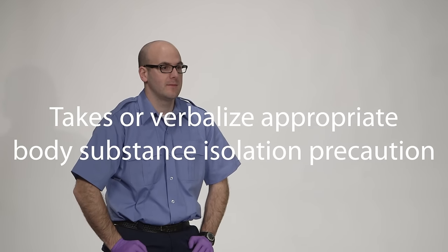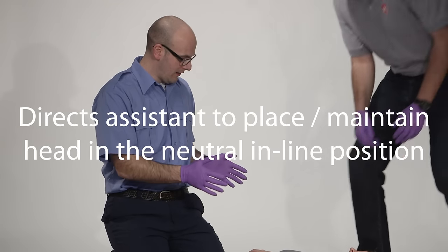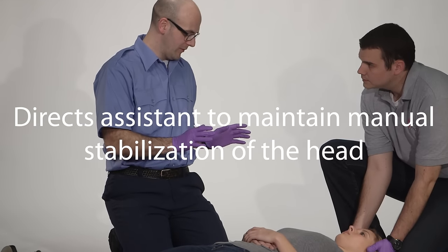BSI — is my scene safe? The scene is safe. The first thing I'm going to do is direct my partner to come in and place the head in an inline neutral position, and then I'm going to direct my partner to maintain C-spine stabilization.